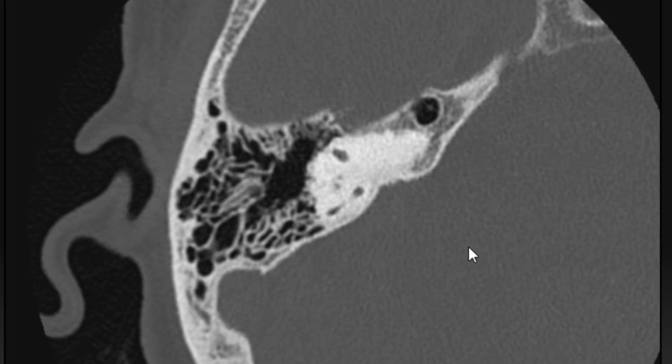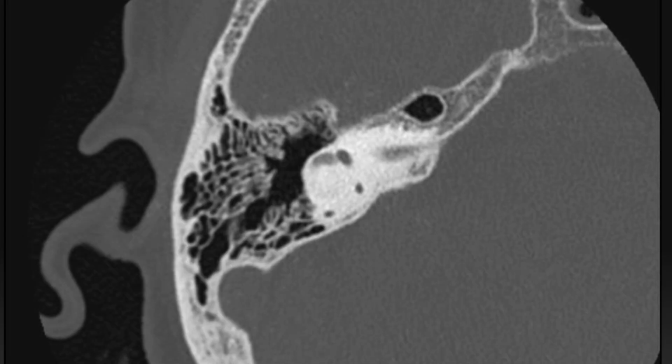The benefit of that too is now you can translate it over to MRI. So if you get an MR for hydrops in a patient, you can immediately diagnose, is there hydrops or not? And at the same time, you measure the retrolabyrinthine bone thickness on the heavily T2-weighted sequence, the Drive, the KISS, the Fiesta, whatever, you can just measure that. And if it's really thick, you have basically excluded the hypoplastic endotype phenotype. But if it's thin, it could be either way, and you could then recommend a CT to do a more precise measurement of the actual vestibular aqueduct.